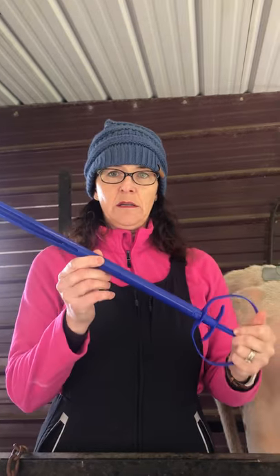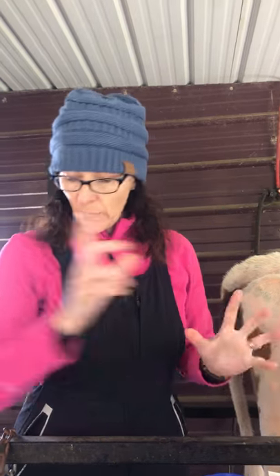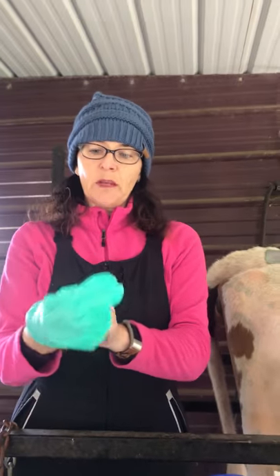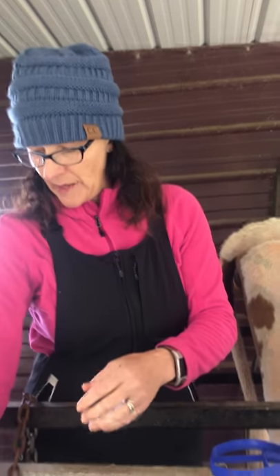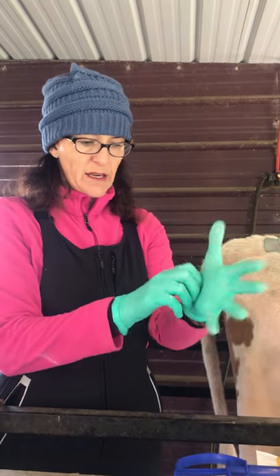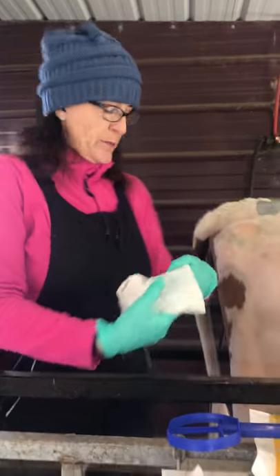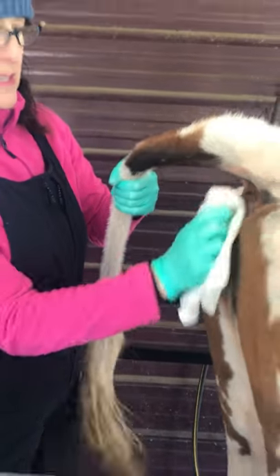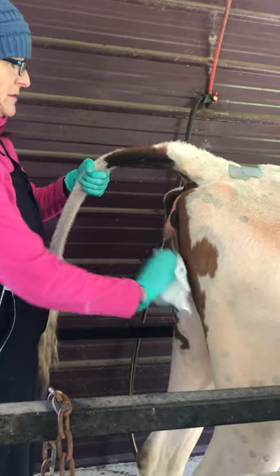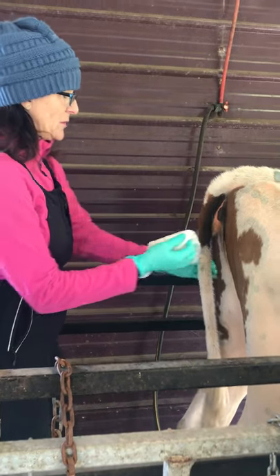This is an Easy-Breed insert gun. I want to use gloves because it's hormones and we don't want to play with hormones. So I'm going to put on some exam gloves that fit me, and then I'm going to clean because we don't want to get anything dirty inside of her. I have a wet rag prepared with some sanitizer on it, so I'm going to clean her really well — we don't want to put dirt inside of her. We don't want infection to deal with, so she's not exactly clean, but we'll keep going.